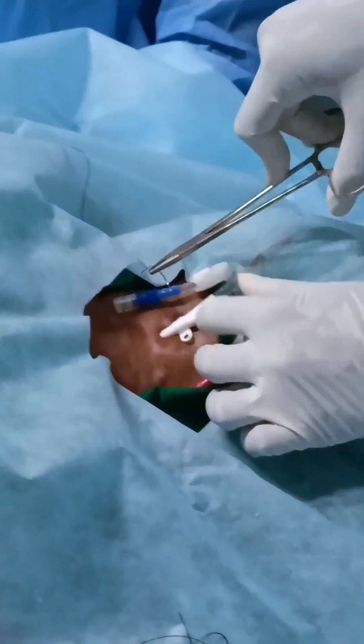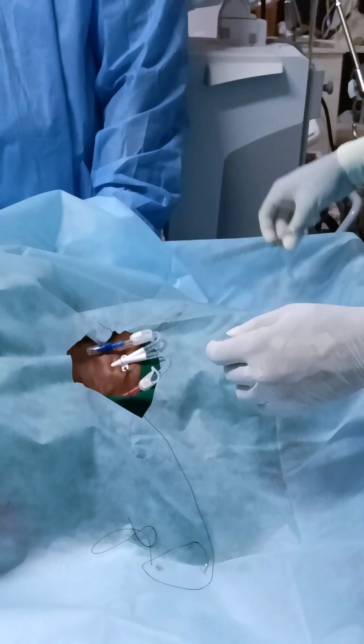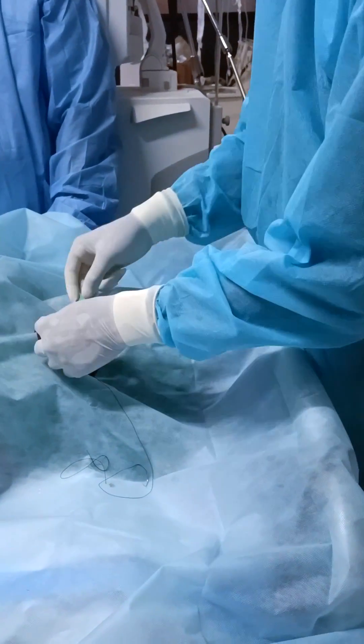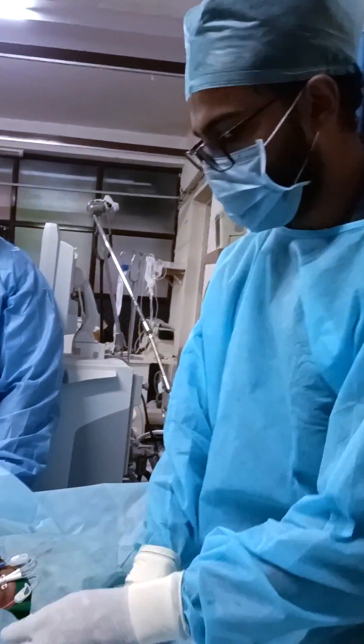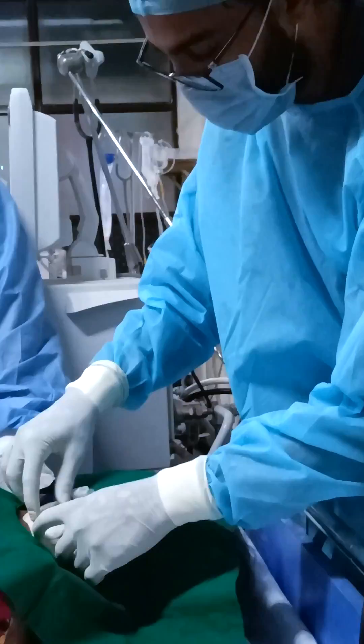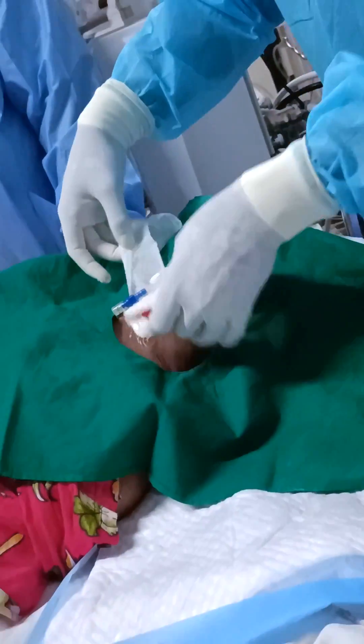Now you need to suture it. Secure the catheter by suturing the integral suture hub into the skin. After suturing, place a sterile dressing over the line. Then a chest X-ray should be taken to assess the proper position of the catheter tip and also to evaluate for pneumothorax.